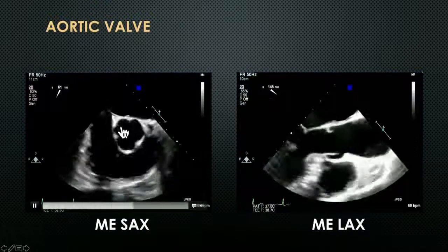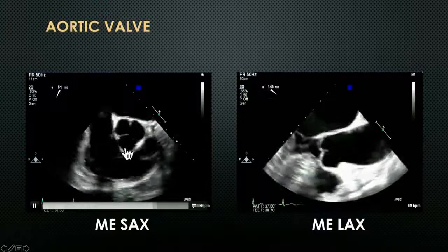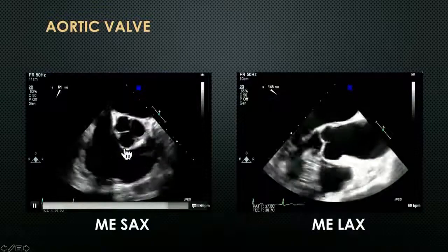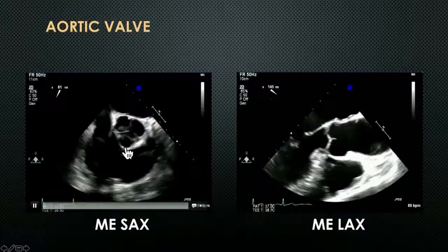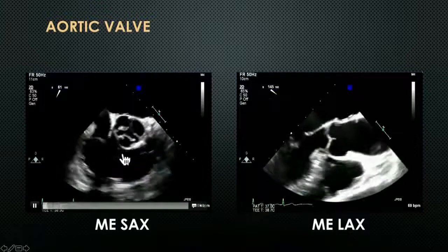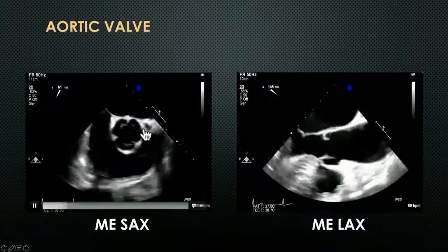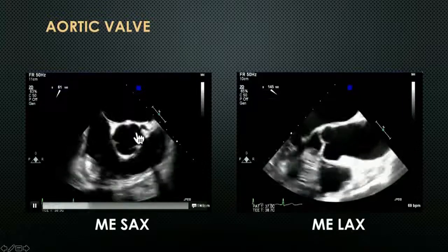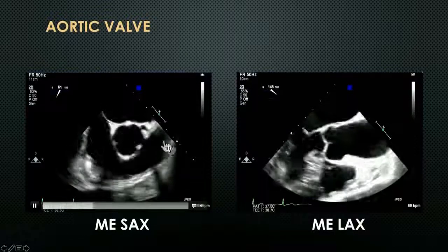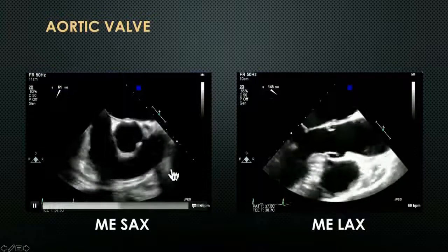This is the non-coronary cusp attached to the interatrial septum. This is the more anteriorly directed cusp, which is right next to the RV. So this is the right coronary cusp, and the right coronary artery would originate somewhere here. And you can see the left main artery playing back and forth with the translation of the heart here. That is the left coronary cusp. So that is the mid-esophageal short-axis view.